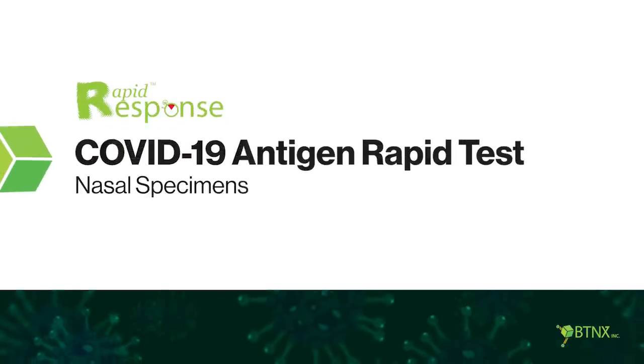This is a demonstration of how to perform a rapid response COVID-19 antigen rapid test.